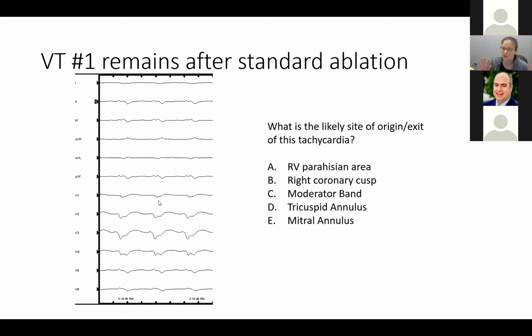So that to me pushes it off a little bit into the septum. So thinking about things that get you into the septum might be reasonable. And then otherwise there's a fairly late transition that's consistent with a right ventricular site. It's inferiorly directed, but definitely not as high as some of the other VTs that we looked at earlier today, and it's positive in 1.